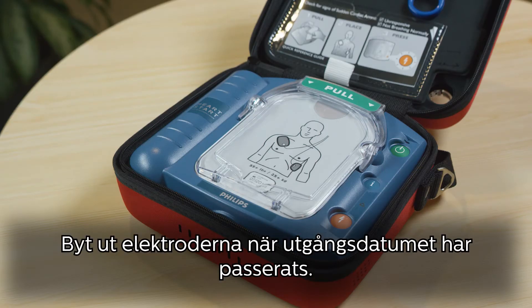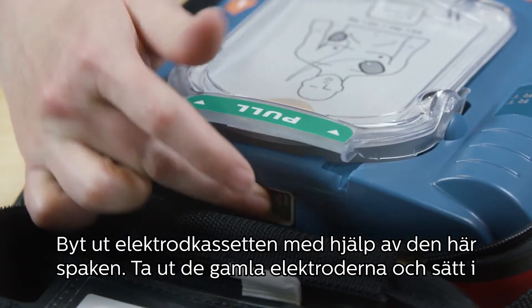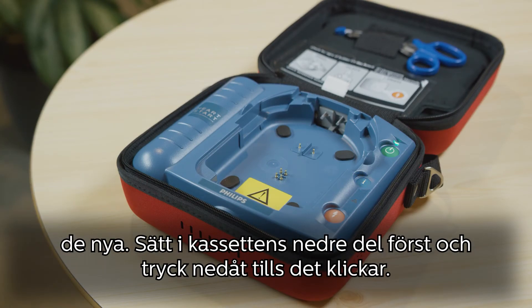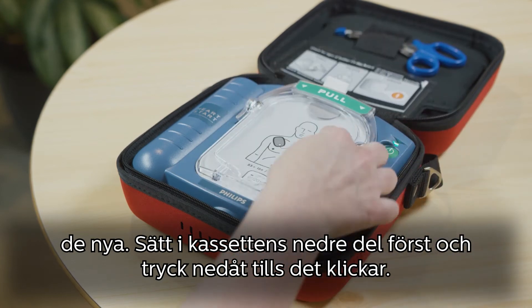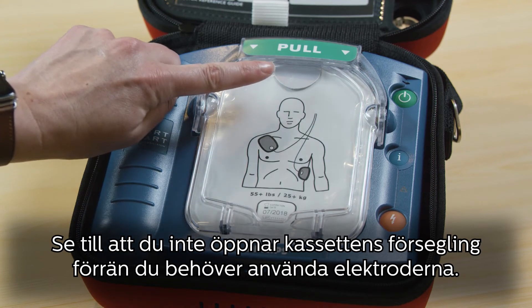Replace your pads when they reach their expiration date. To replace the pads cartridge, slide this lever to pop out the old pads and drop in the new pads, placing the bottom end of the cartridge into the compartment first and pushing down until it clicks.